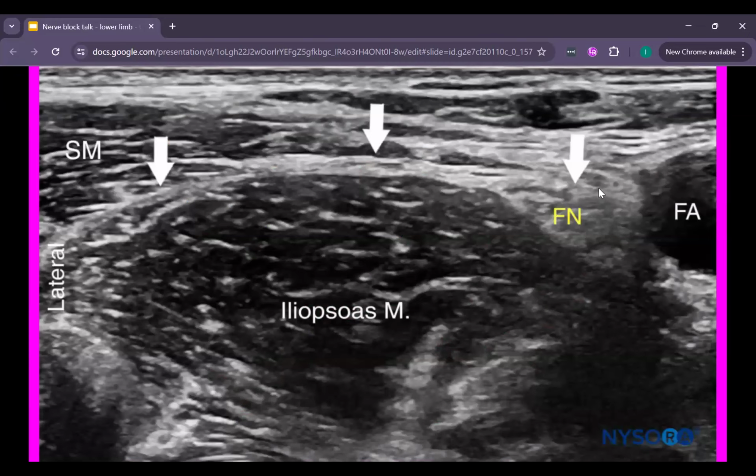So you can see here, very similar to our femoral nerve block anatomy. You can see the femoral nerve here. Laterally, we see this fascia iliaca fascia layer very nicely on the ultrasound image here. And the idea is that we'll just come in laterally with our needle, pop below that fascia lata here, pop below the fascia iliaca here. So that's our 2-pop technique. And then we're just spreading local anesthetic below the fascia iliaca here, and we'll see spread medially and also see spread laterally towards the lateral femoral cutaneous nerve.